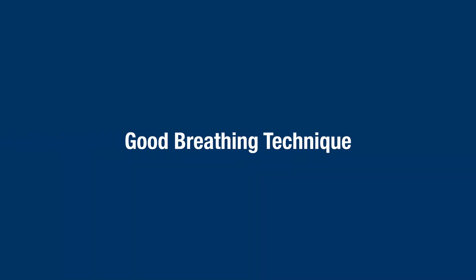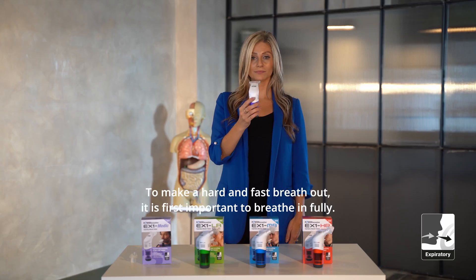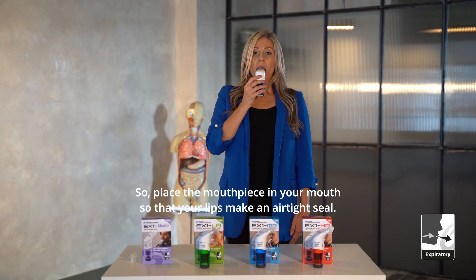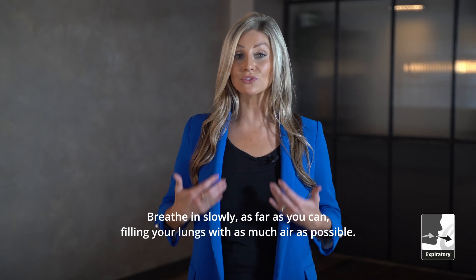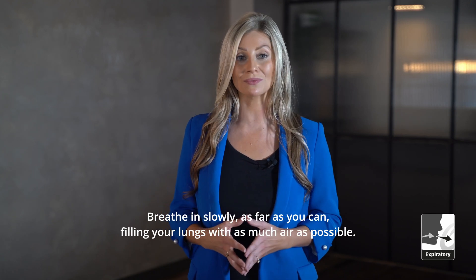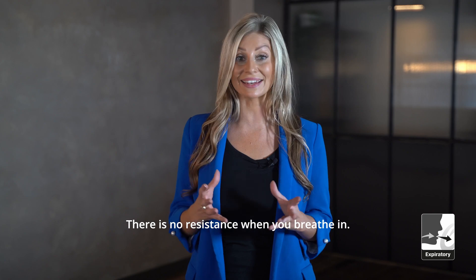Good breathing technique. To make a hard and fast breath out, it is first important to breathe in fully. Place the mouthpiece in your mouth so that your lips make an airtight seal. Breathe in slowly, as far as you can, filling your lungs with as much air as possible. There is no resistance when you breathe in.